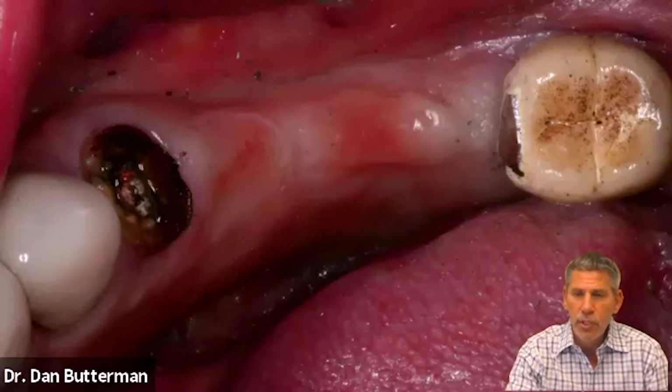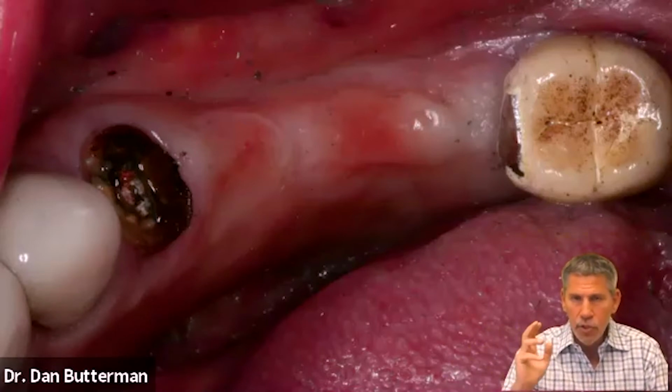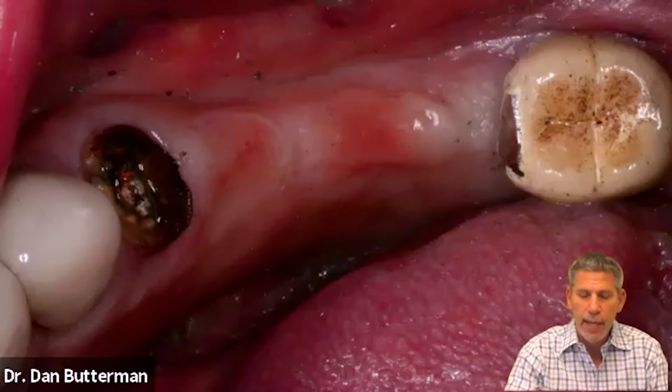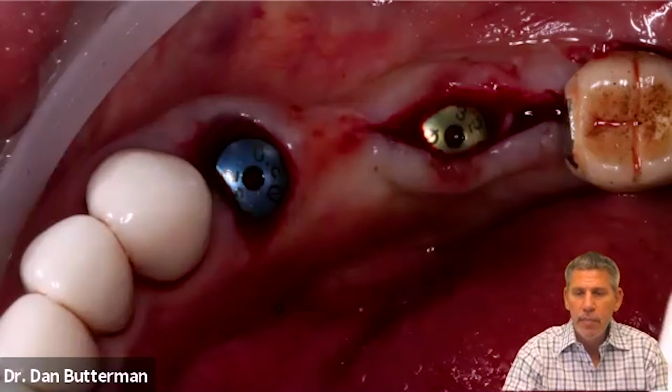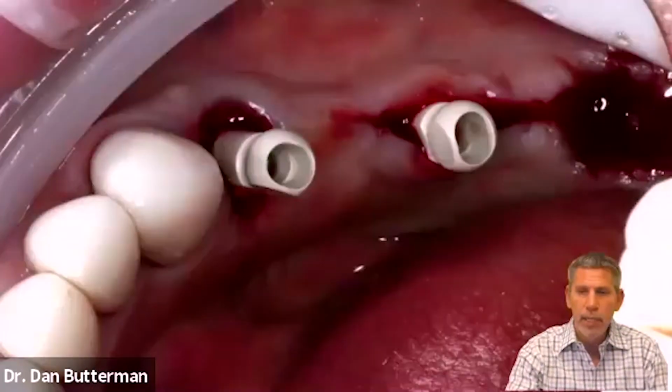Even though I'm planning to extract it, I left it to help support the guide. So I told CCAT, hey, I want you to virtually extract the other teeth, but leave that one because it'll help support my guide. So the implants are placed. These are 2 Astra EV implants. We just did a very, very small flap for tooth number 19, and no flap where the extraction was happening for tooth number 21. And then the implants go in.